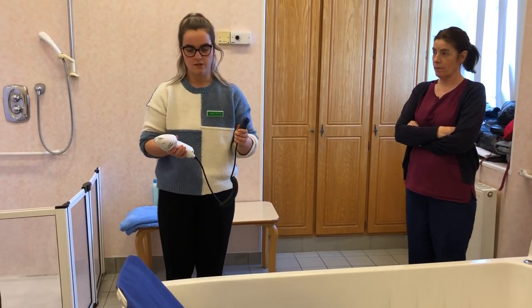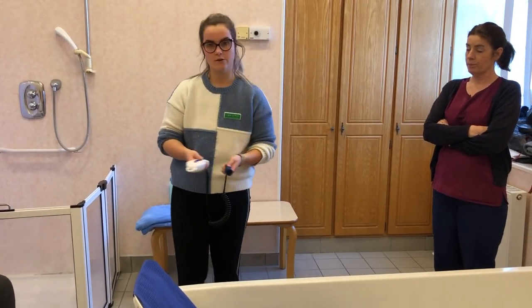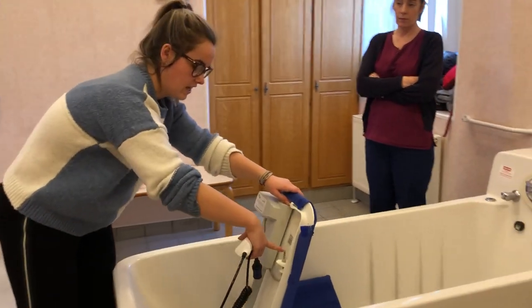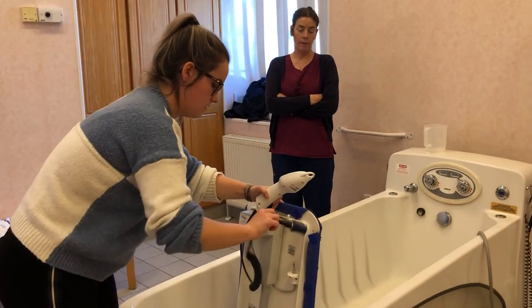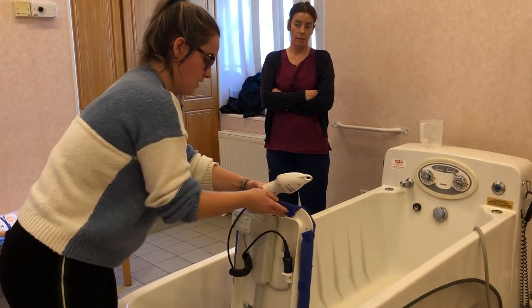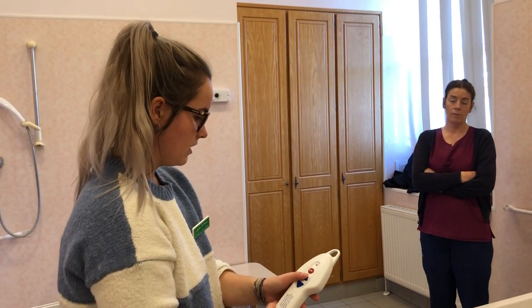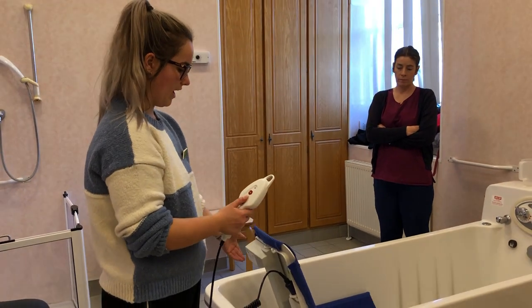This is the remote control for the bath aid. You should always make sure that your bath aid is fully charged before you use it. Then you connect this piece into the connection at the back here — push it down and make sure it's fully down.